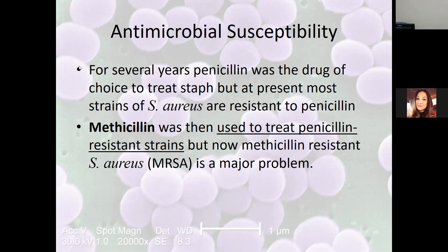You test that. Yeah. We're going to do that downstairs. Not today, but we have an antibiotic panel that we're going to load. It's called a combo plate. You're going to see them over to the side. We're going to load the organism in there, and if it grows the next day, then it's resistant to that antibiotic. If it doesn't grow in that well, it's sensitive.